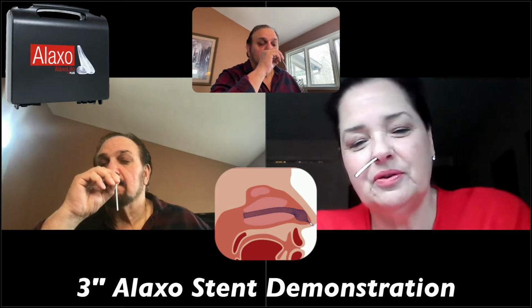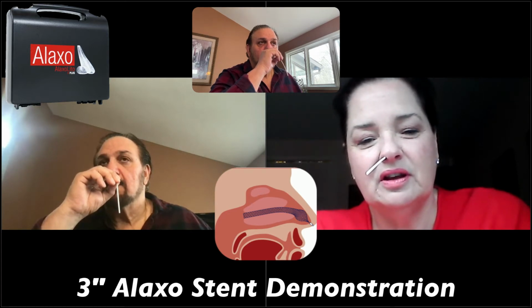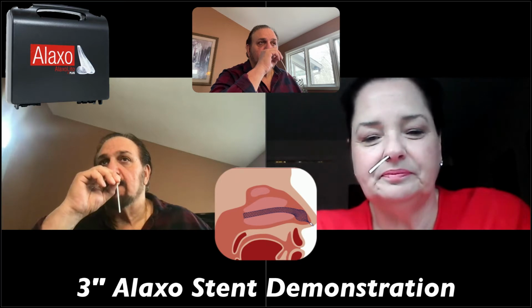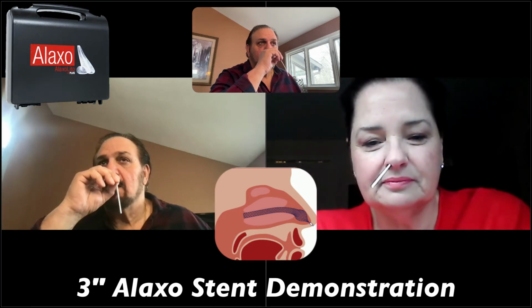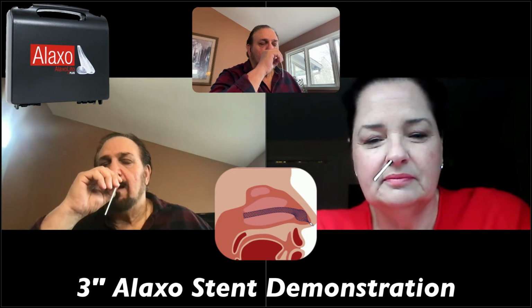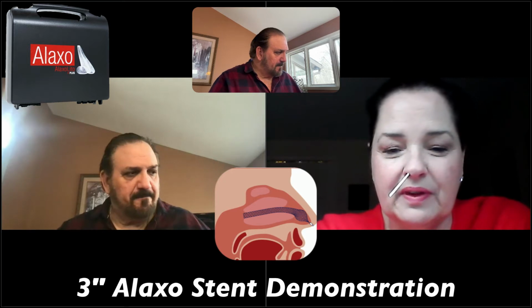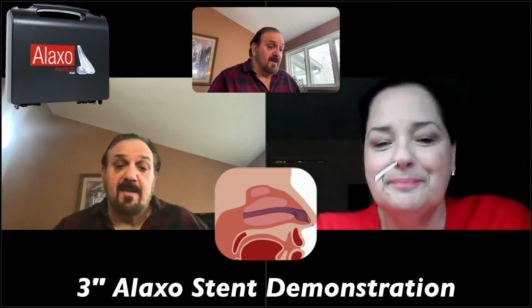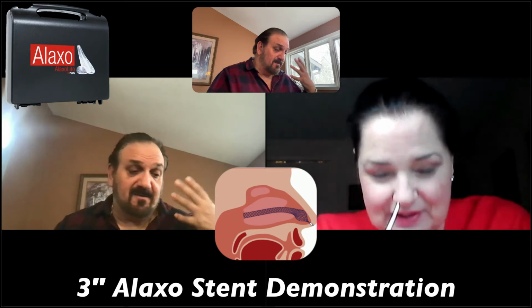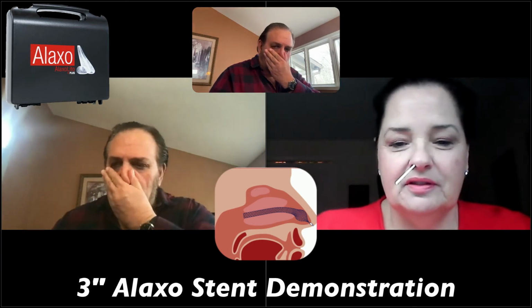Are you pointing upward, or are you going along the base of the floor of your nasal cavity? Trying to go along the base. I'm getting a little bit further each time, it seems. Oh wow. That's no problem. Wow. And it's not pain that I'm feeling. It's just the whole body is reacting and closing up, and mucus, and all of that stuff. For sure. It's no problem.